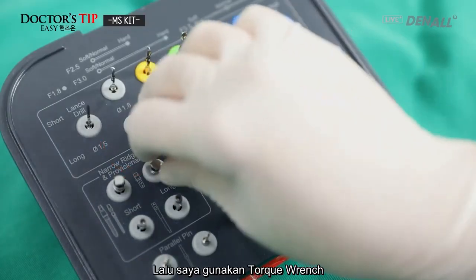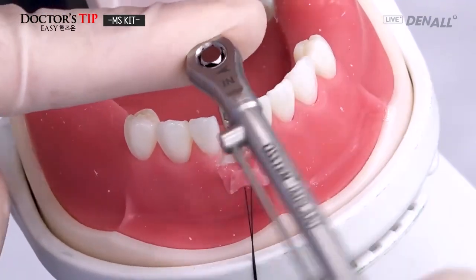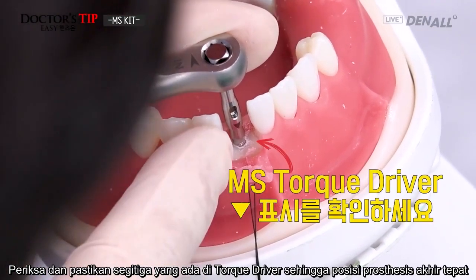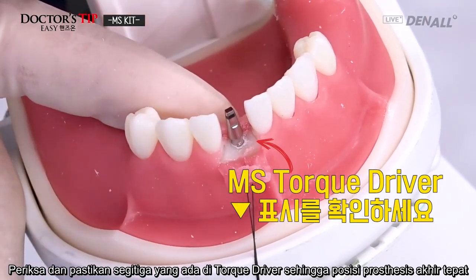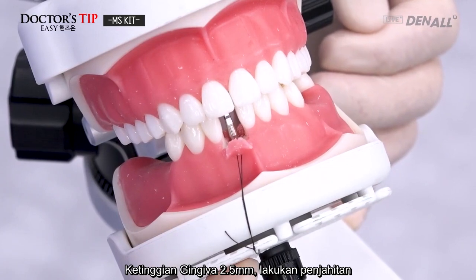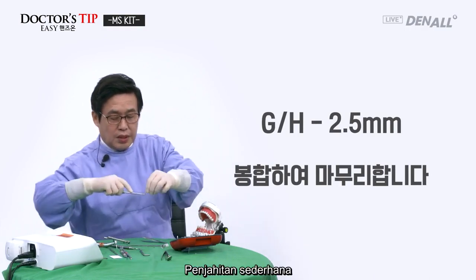And then I use this torque wrench. And you do the placement, final positioning. Again, this triangle exists on the torque driver, so the position of the final prosthesis can be checked. And let's see whether it's aligned. Gingival height is 2.5 millimeters, and I'll do suturing. Very simple suturing.